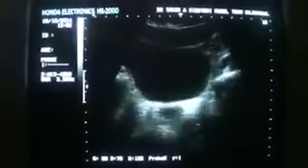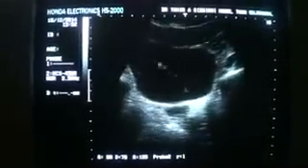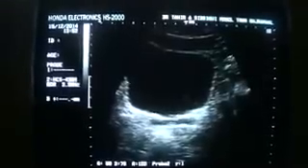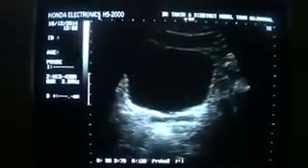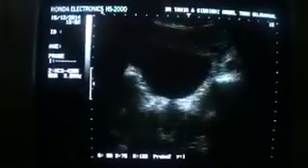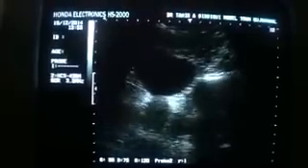With a urine-filled urinary bladder, this is the urinary bladder. This video is regarding how to measure the prostate. This is the terminal rectum area. Here you will come across the prostate in transverse section. This is the prostate in transverse section.